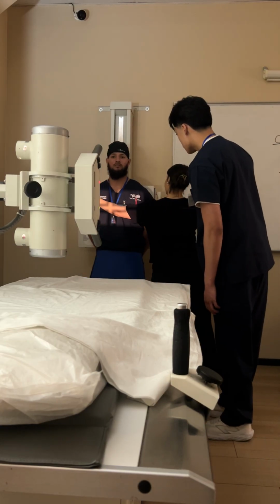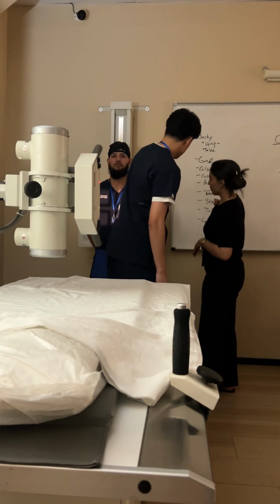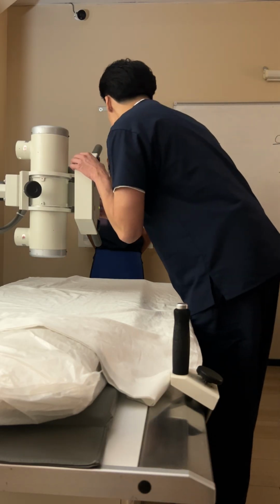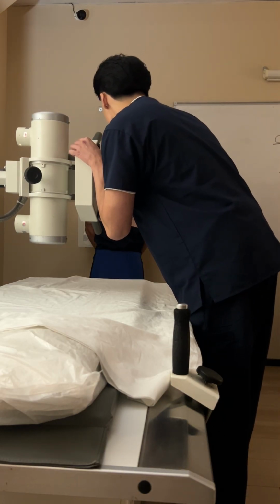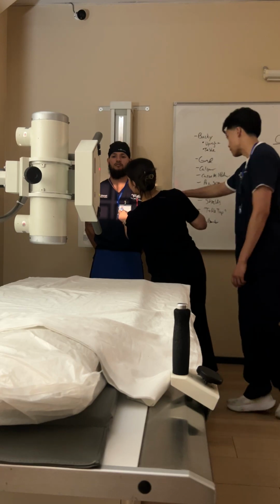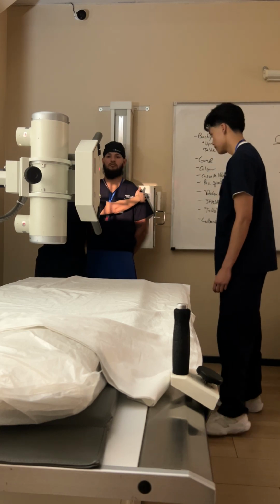On the width size, you want the light to be shown on the IR? For a chest X-ray, unless they're a really small person, I don't do a whole lot of collimating because I don't want to clip the sides of the chest, the apices, or the costophrenic angles. If my cassette is crosswise, I probably won't collimate much. If it's lengthwise, I might move it up a little and bring it down just a hair so I don't have as much abdomen. But typically, I don't do a whole lot with it.